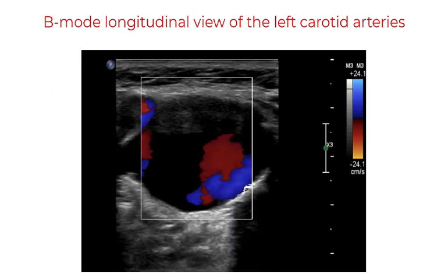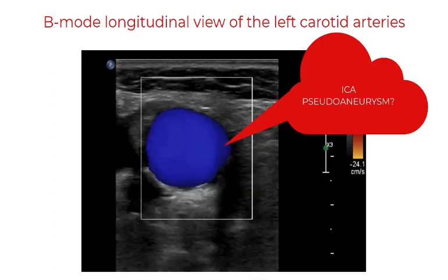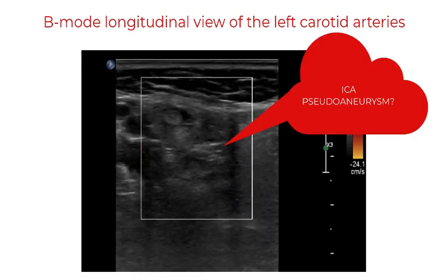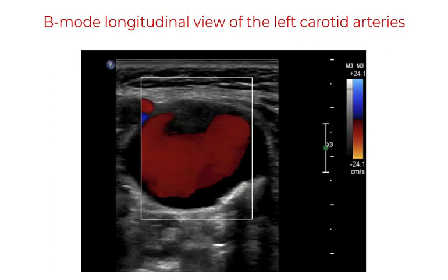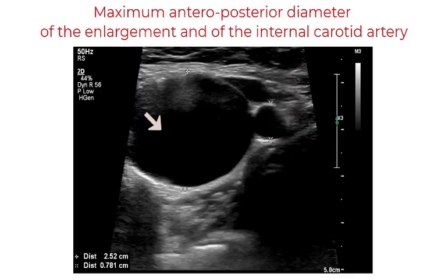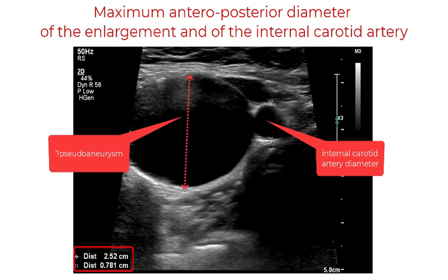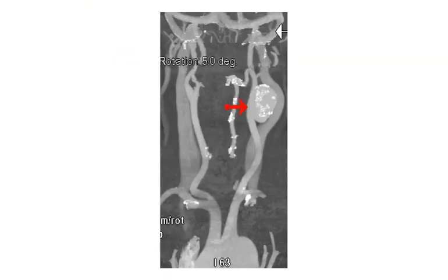This would highly be suggestive of a pseudo-aneurysm of the internal carotid artery. As we can see, flow is going from the internal carotid artery into this anechoic region. By measuring the size of this anechoic region, we can see that the maximum diameter is 2.5 cm.